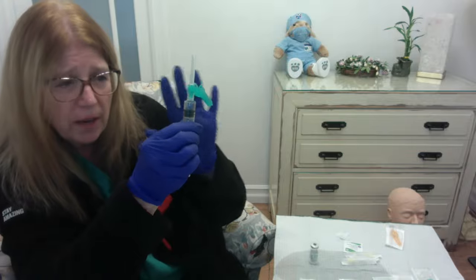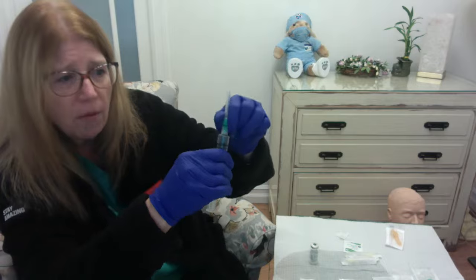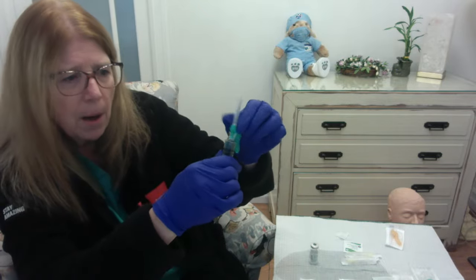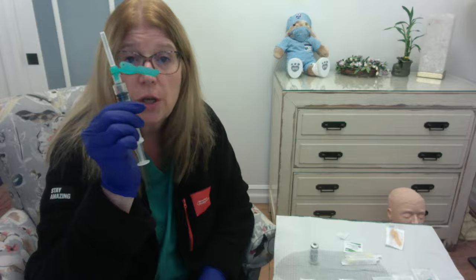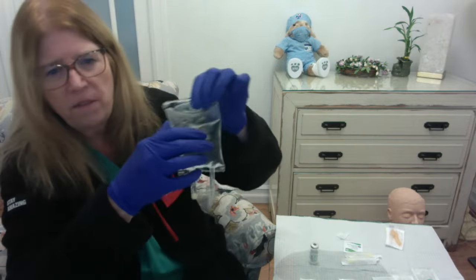So if I'm going to inject this into a patient, I'm going to take this whole needle off, right? And I'm going to change it to the needle that I need. But if I'm going to simply inject this medication into an IV bag, I don't need to change the needle, okay? So let's do that. Let's inject it into an IV bag.